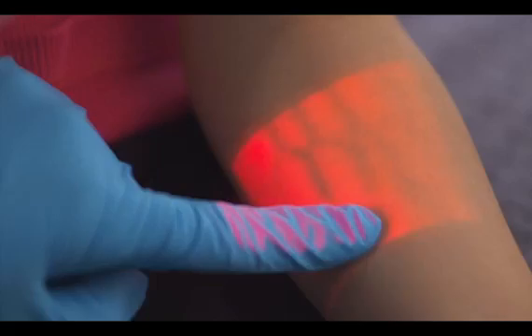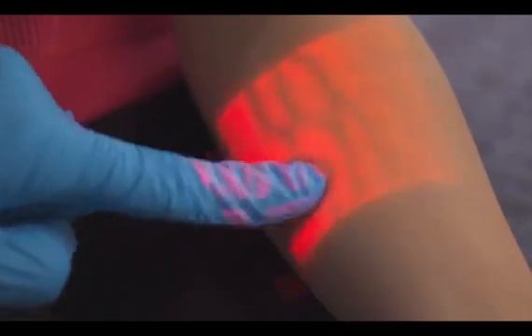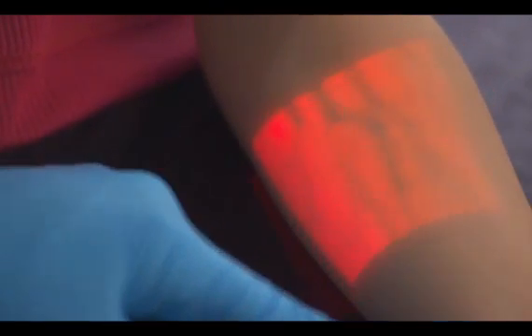The wipe technique is used to verify vein patency. By occluding and wiping the vein, you can verify blood refill as well as the structure of the vessel. This helps you avoid valves and bifurcations during cannulation, so you avoid damaging or blowing the vein.